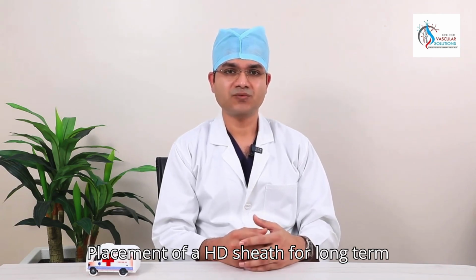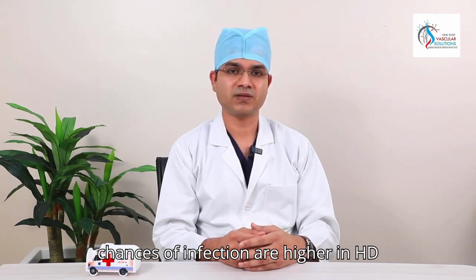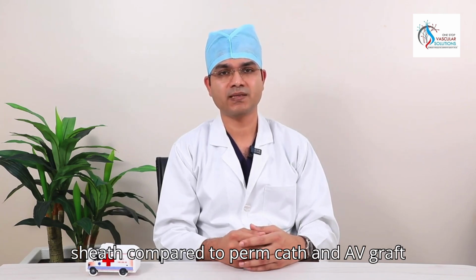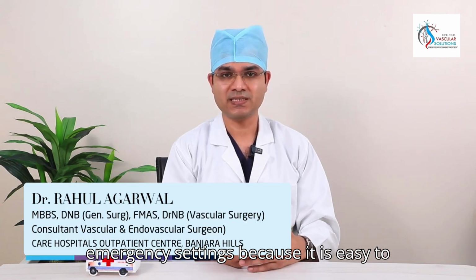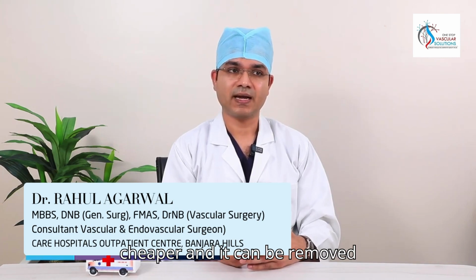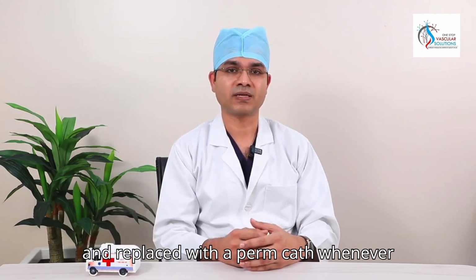Placement of a HD sheath for long-term dialysis is not preferable because the chances of infection are higher in a HD sheath compared to perm cath and AV graft as well. But they are preferred in emergency settings because it is easy to do, it is cheaper, and it can be removed and replaced with a perm cath whenever required.